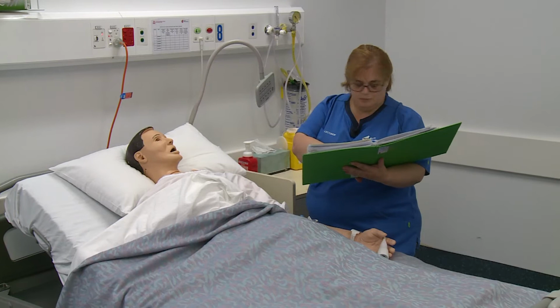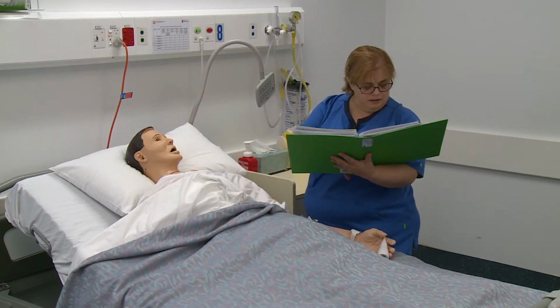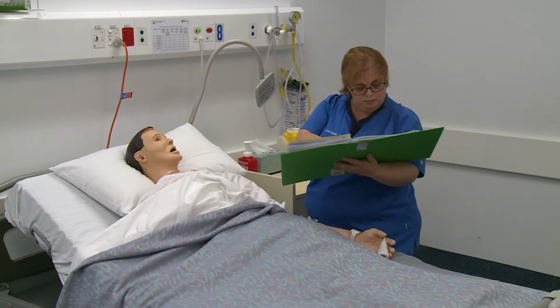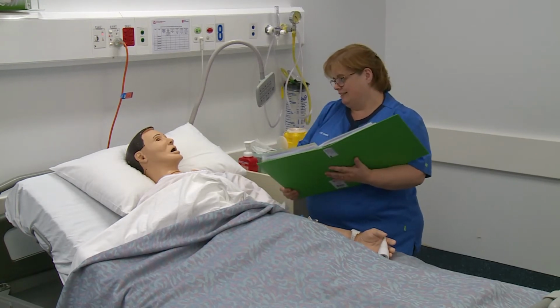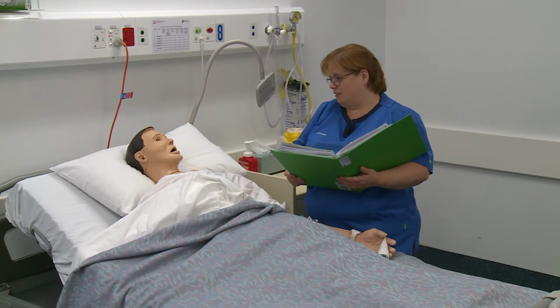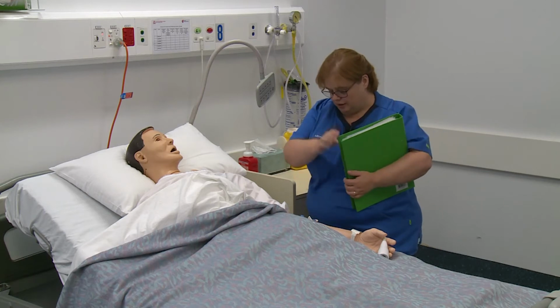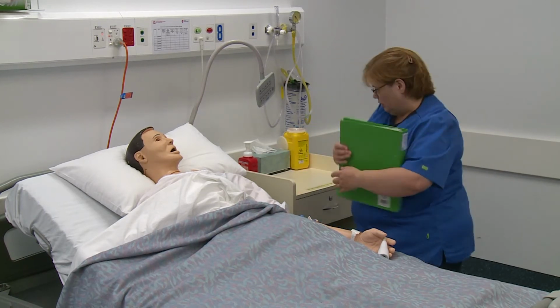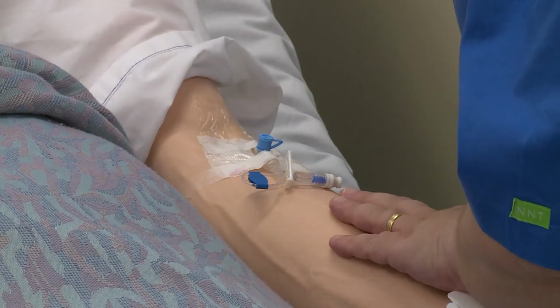So have you had amoxicillin before? No? Okay, so actually you're prescribed 1 gram of IV amoxicillin and it's due now at 12 o'clock. Okay, are you happy for us to proceed and do that for you? You are? Okay, but before I get started, I'm going to have a quick look at your cannula and check that it's okay to use.